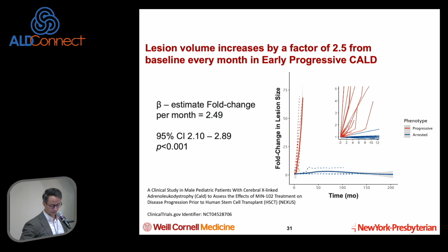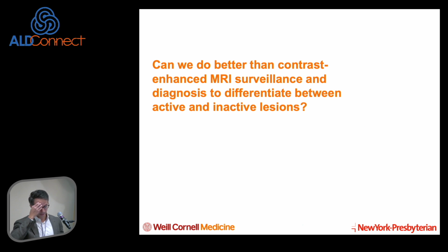And some of these imaging outcomes are being used as investigatory outcomes for clinical trials that are ongoing. But really what I wanted to get to, and this is what I think is important to parents, is if we're going to do contrast, if we're going to do MRI surveillance, do we have to give our kid contrast every single round? And then how do we factor in having to sedate the patients when they're younger? Do we just give contrast because they're sedated and make use of their time?